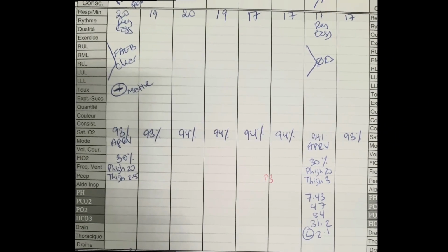So by using the diffusion capacity on patients with low FiO2s, it's quite impressive, you just see some of them diffusing gases so well that you end up getting rates of 6 and 8. That's wonderful, especially when the lung is not perfect. Therefore, by using the diffusion of the lung, you're able to move the chest a lot less, and you're able to protect it. All right, thanks guys. I'll show you the blood gases.